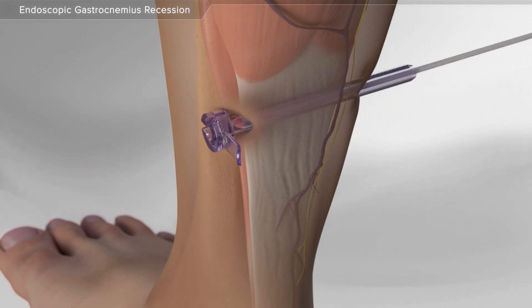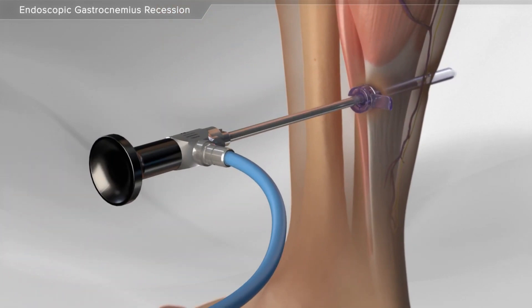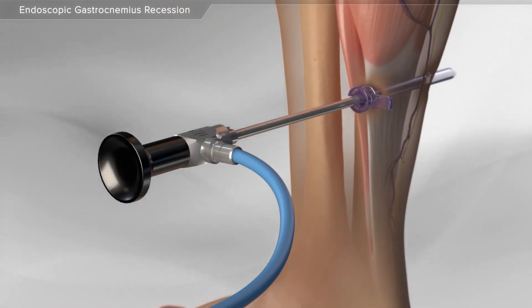Next, swabs are passed through the cannula to remove any debris. Next, your surgeon inserts a camera into the cannula to see the calf muscle.